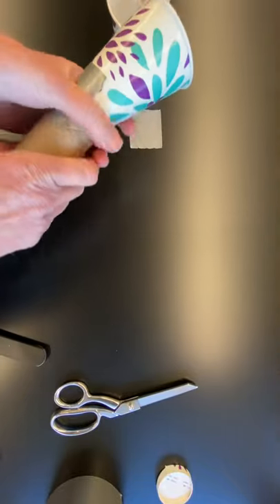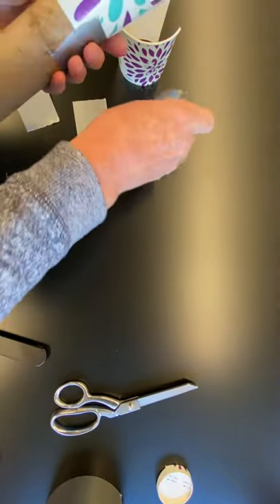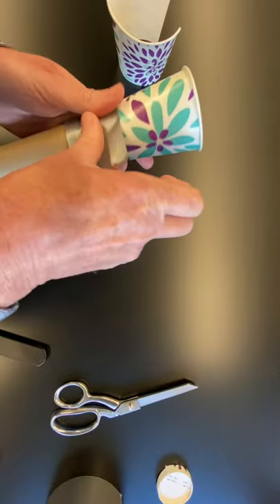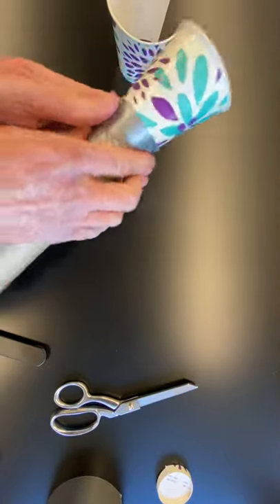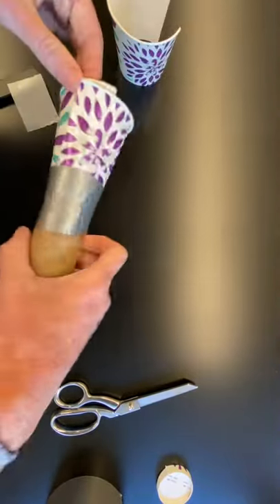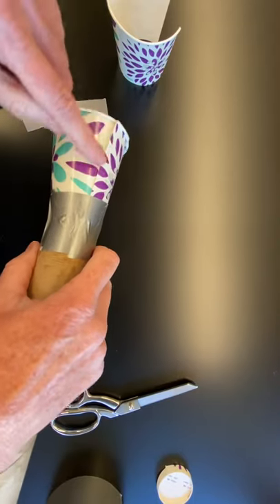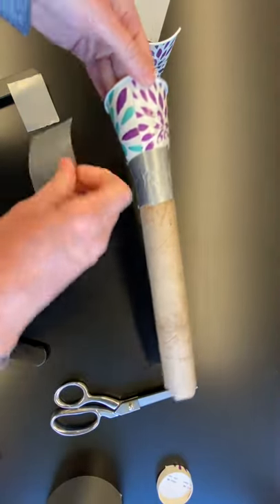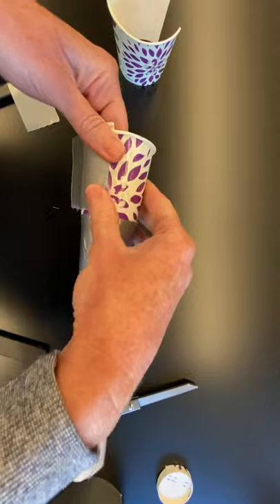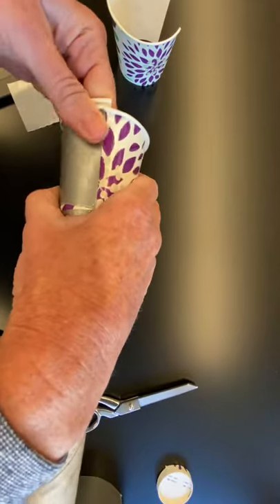So I can secure my cup onto the end of the paper towel roll like this. And then where I cut it down the side of the cup here, I'm also going to tape this piece closed like that.